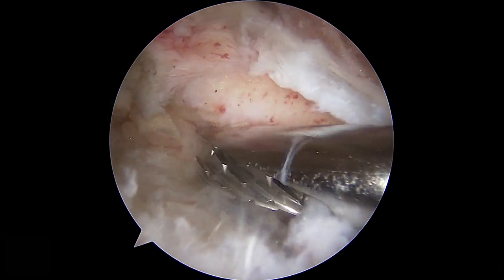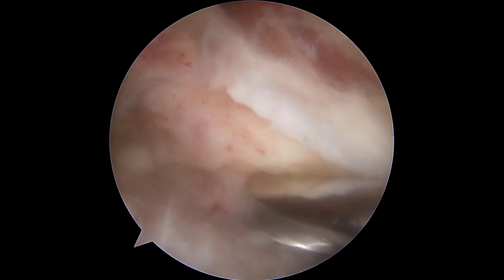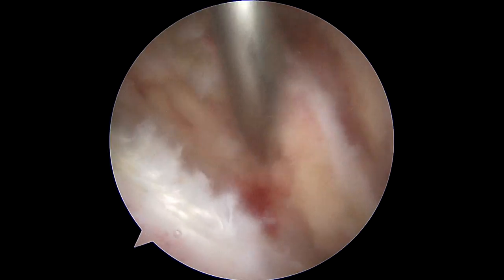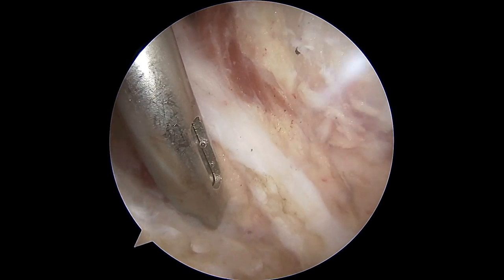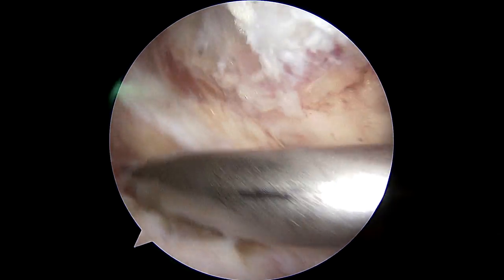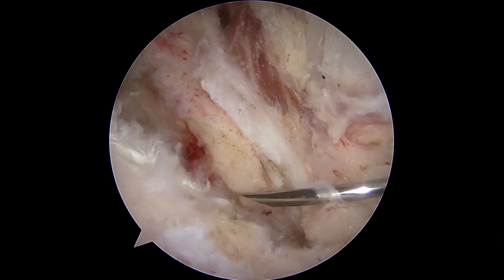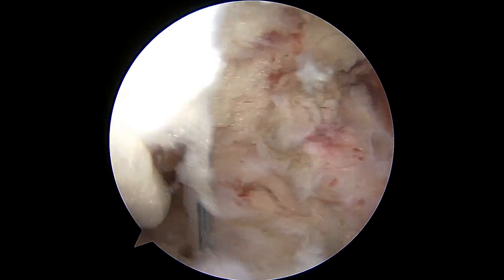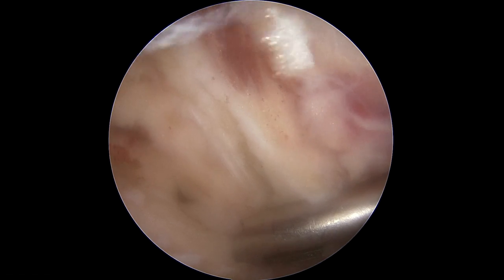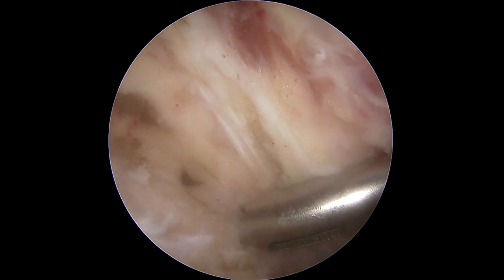Very important again — run the burr on reverse, get rid of the soft tissue so you don't decorticate. Now let's see where our posterior anchor is going to go. After checking angles with a needle, it looks like just posterior to the scapular spine is going to be about right. The suprascapular nerve is right at the base of the scapular spine — I'm still about a centimeter away from that. That also helps you not slip if you're drilling on a real oblique surface.